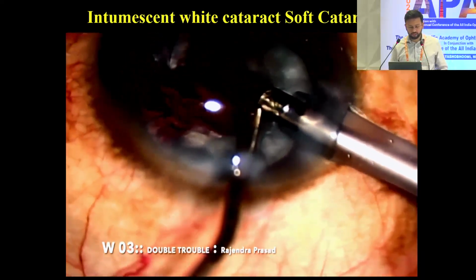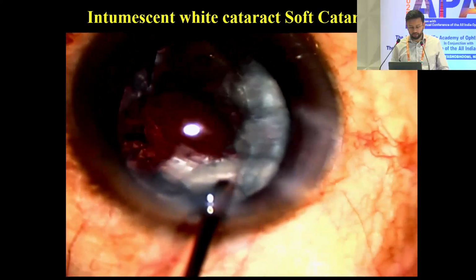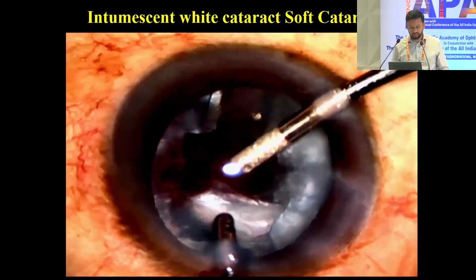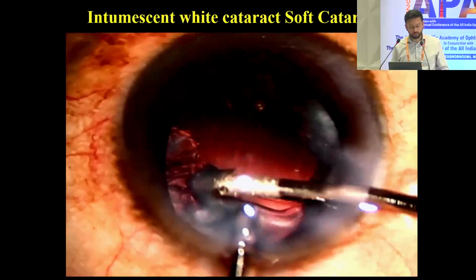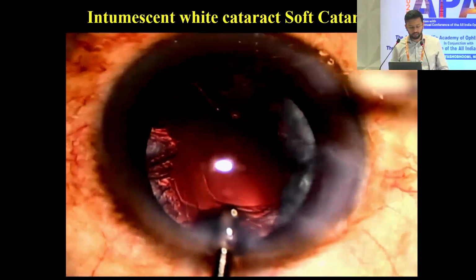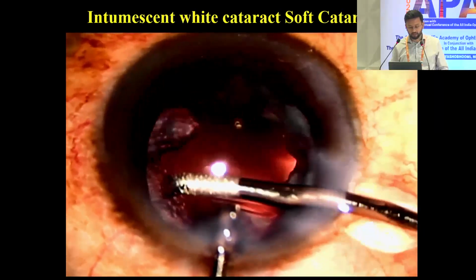We removed the nuclear fragments, and the rest of the cortical fragments we attempted to remove through the main incision. So the key step is to continue irrigating and put lots of viscoelastic, preferably dispersive. And here you can see we are pulling out the fragments one by one directly out through the main port.